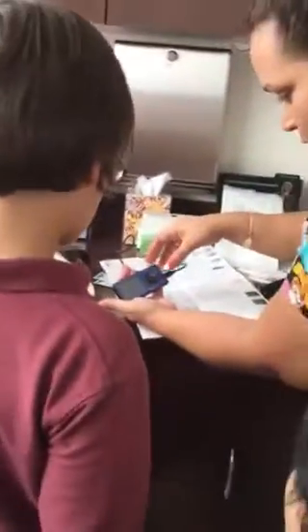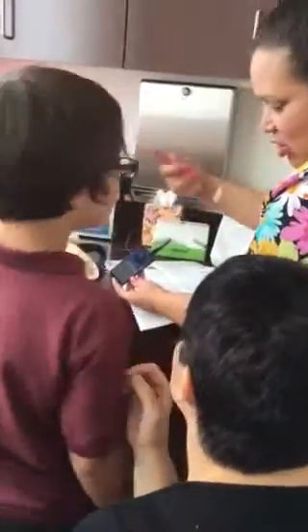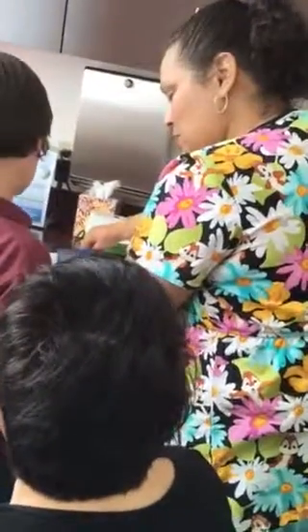After the sensor goes in, you have to wait a little bit until it shows. See here — 'Start Sensor.' You're gonna wait two hours until we check your blood. You'll see this little clock will count down. See how it looks like that? It'll look like this, and then when you see the two drops, that means it's time to check your blood.